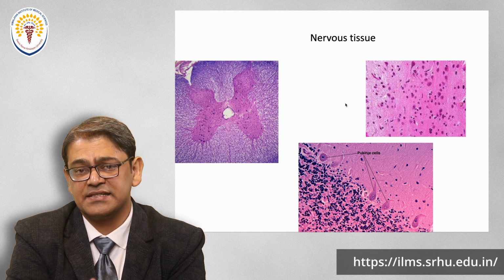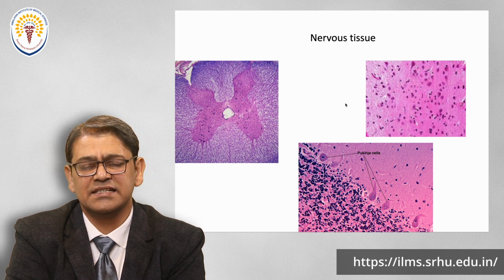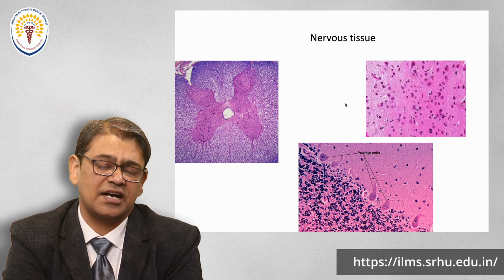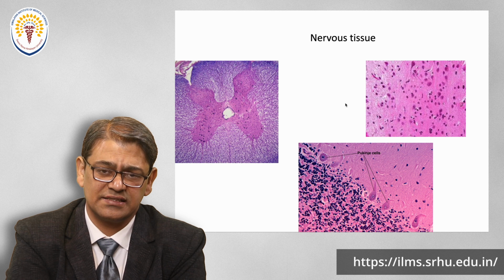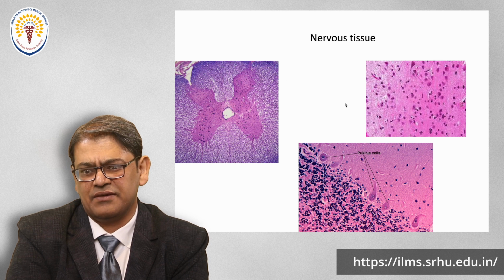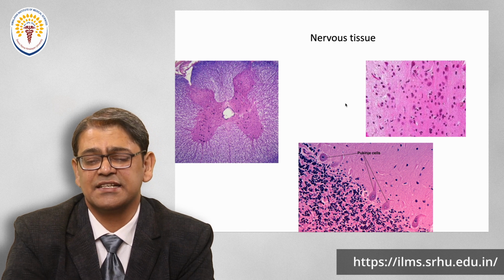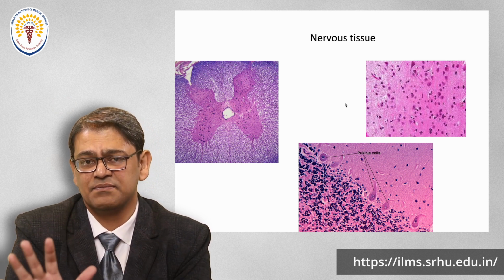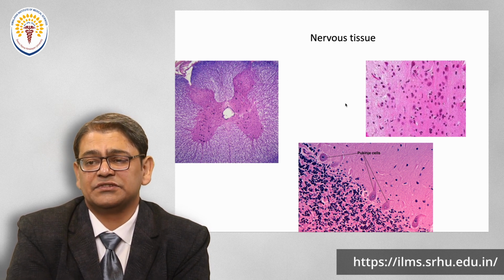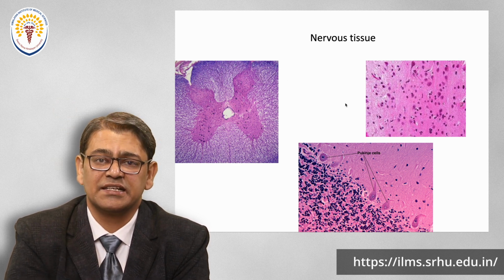So these are the three basic slides: spinal cord, cerebral cortex and cerebellum. Besides this, there are other slides of ganglion and peripheral nerve structures which undergraduates should understand. But these slides are not very well visible under H&E staining. We need special staining. If you do certain special staining, these slides can show their real magic and what exactly is present in the histology. Why is it so? There is myelination over the nerves, and myelin is made up of fat-dominating chemicals.